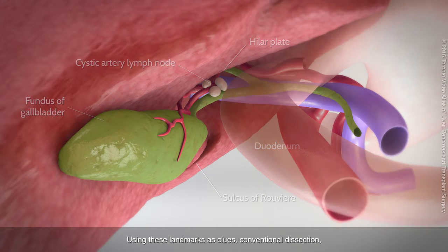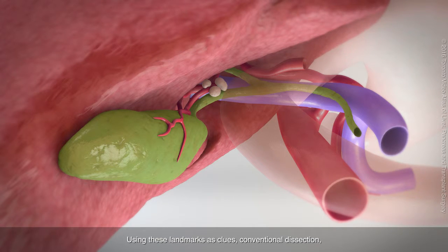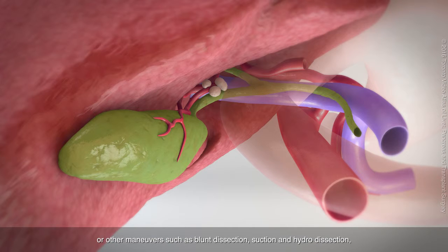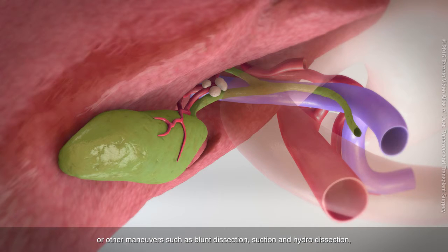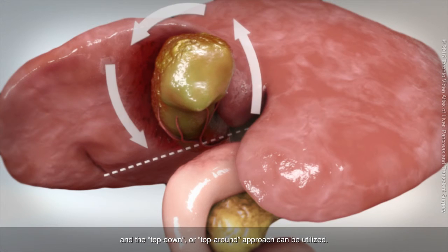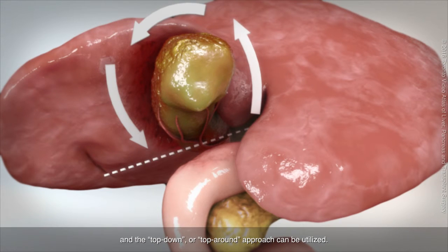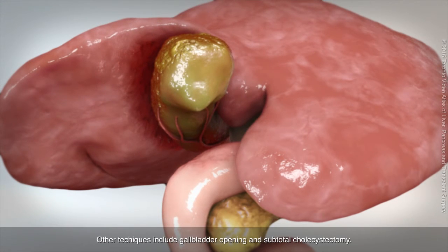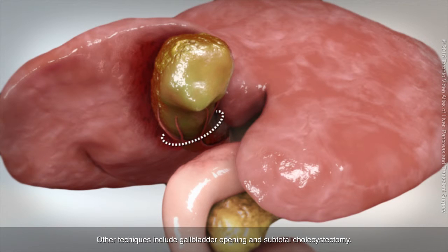Using these landmarks as clues, conventional dissection or other maneuvers such as blunt dissection, suction, and hydrodissection, and the top-down or top-around approach can be utilized. Other techniques include gallbladder opening and subtotal cholecystectomy.